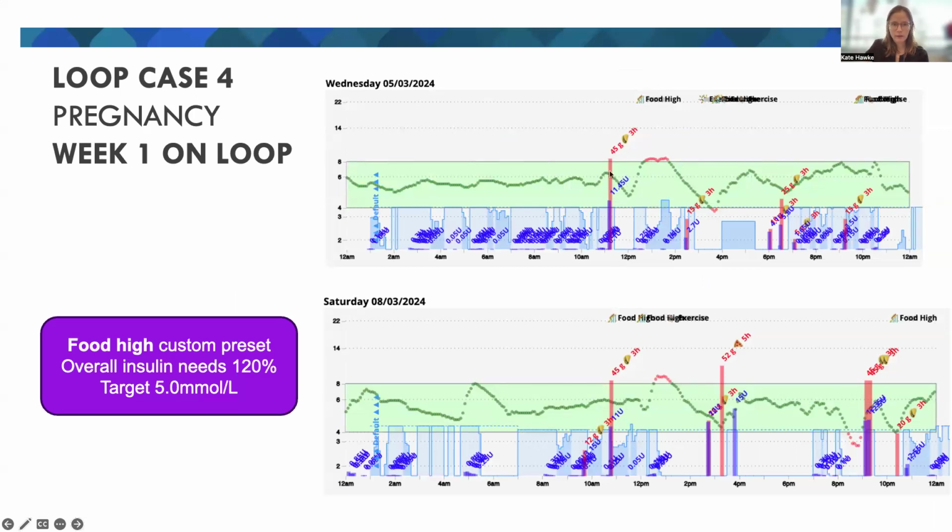So you can see here, we've had our meal bolus, and as is often the way, we get some suspend of basal post-meal. That's maybe okay because we are on this downtrend, but we know we're going to need some solid delivery of basal insulin and probably a few clicks of auto correction along the way to get us through that 2 hours post-meal without edging out above our 7.8.